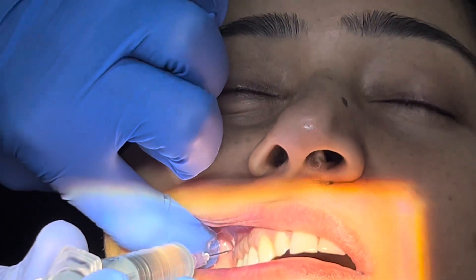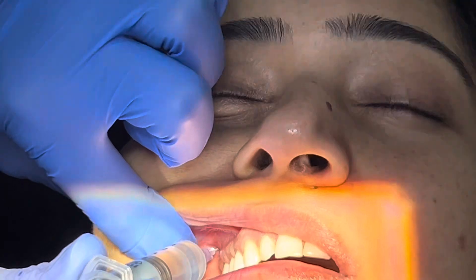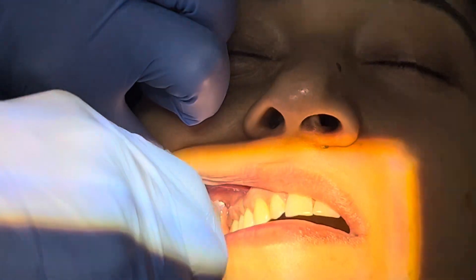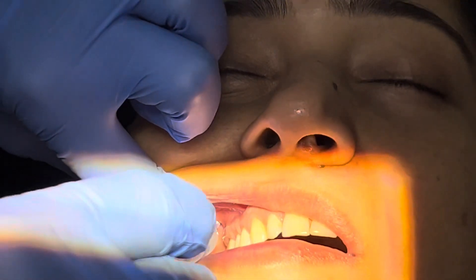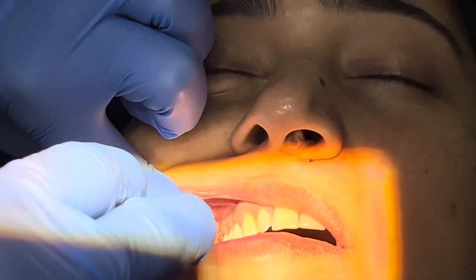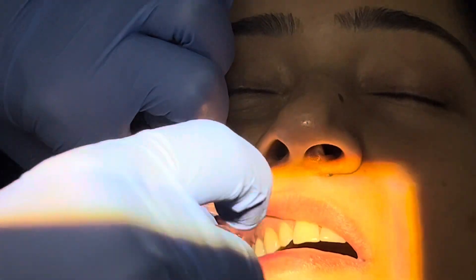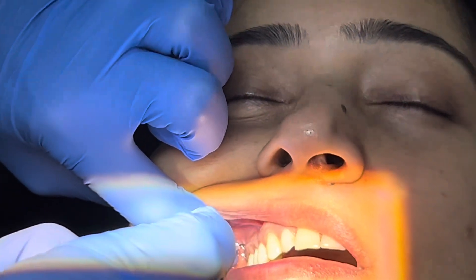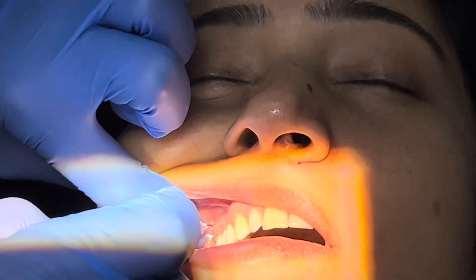We insert the needle here. We don't have to feel bone contact here. This is where we need to aspirate two times — aspirate, change the angle of the bevel, aspirate again. After two negative aspirations, we can inject slowly and deposit around 1.8 ml of the local anesthetic solution.